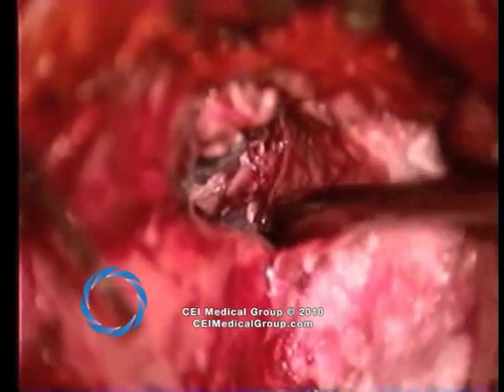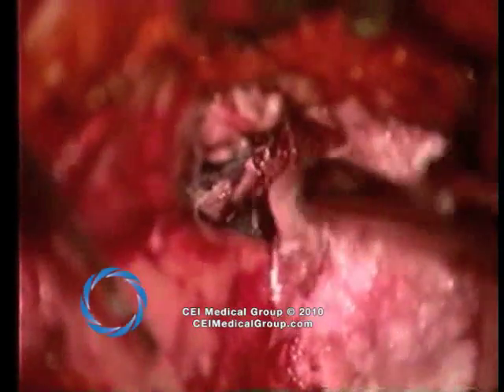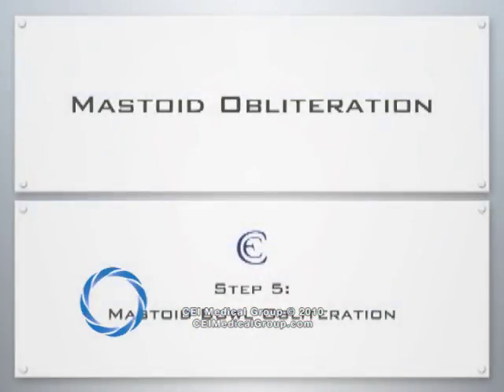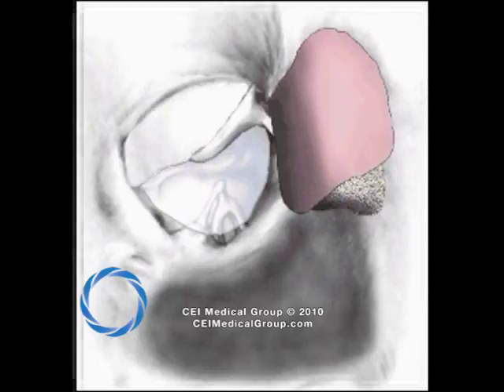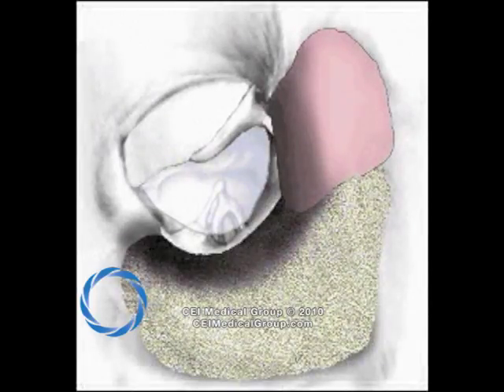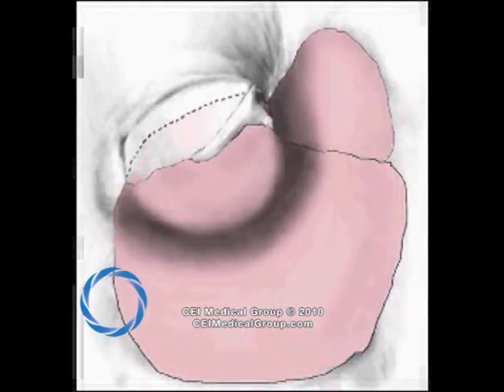The retractor is now directly over the dehiscent facial nerve. In sequence, the mastoid bowl is then obliterated, reconstituting a relatively normal external auditory canal contour. Schematically, the epitympanum has been finished and the mastoid is filled with pate. A single piece of fascia is utilized to both reconstruct the tympanic membrane, abut the facial nerve, and cover the fascia posteriorly.